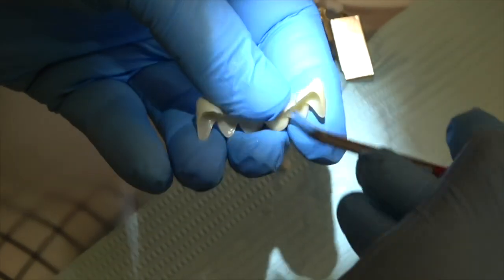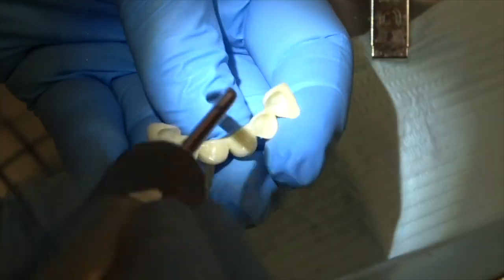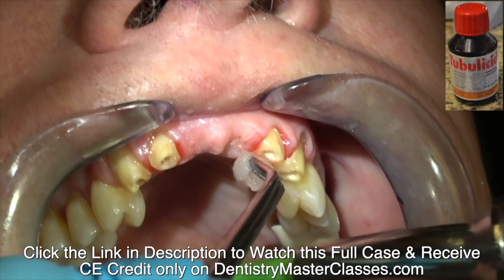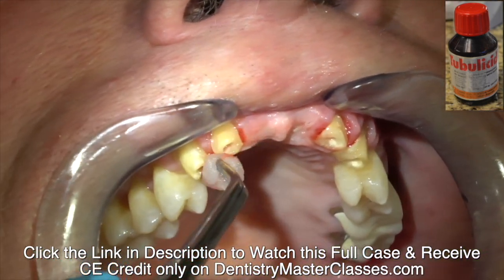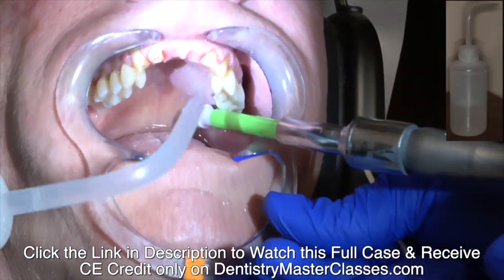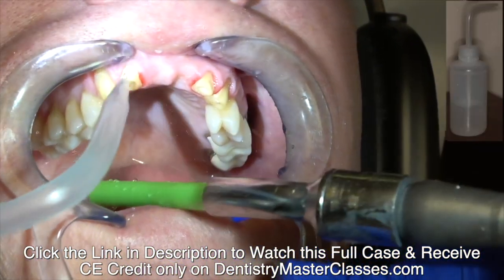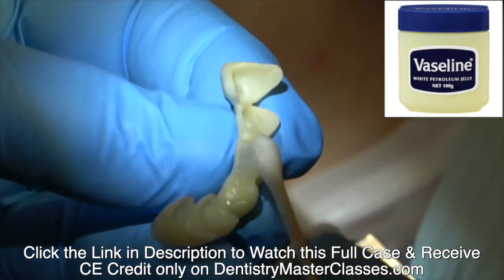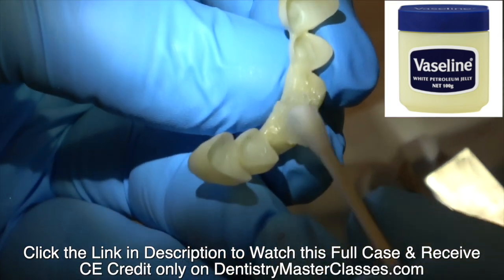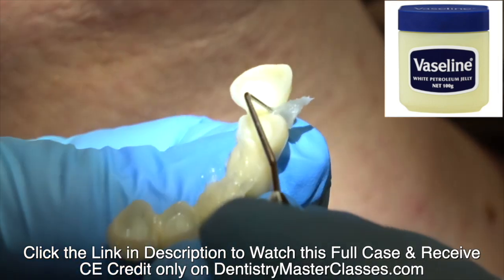The zirconium has been treated in the laboratory. Now I'm alcoholing it just to clean off any saliva, dry it real well, wiping the teeth with Tubulicid Red just to clean them real well, and placing Vaseline in the pontic areas and the interproximal areas so the cement doesn't set up in those areas and make it difficult to remove.